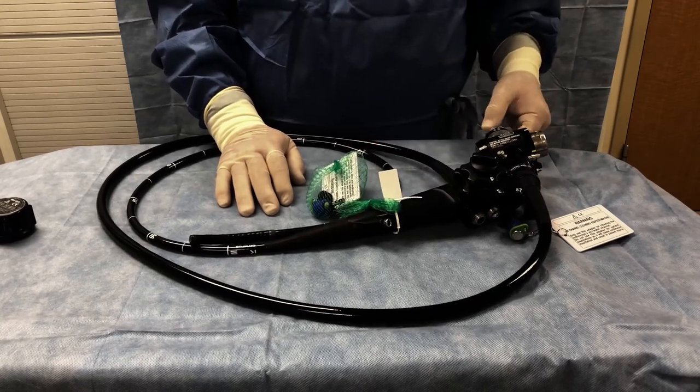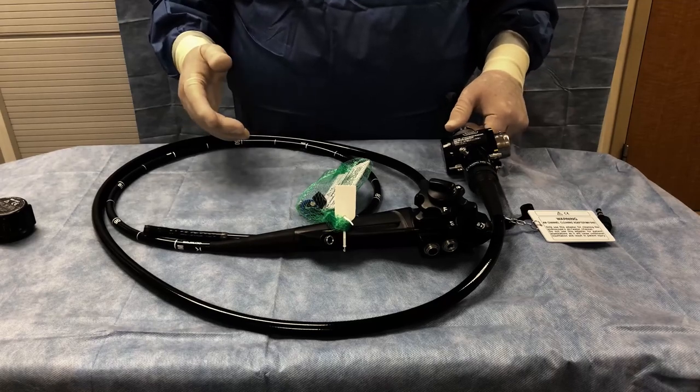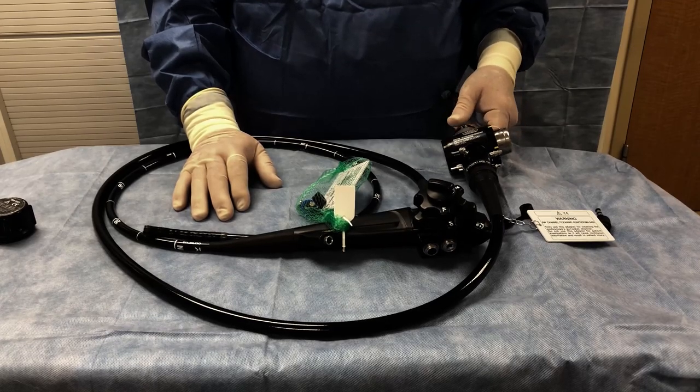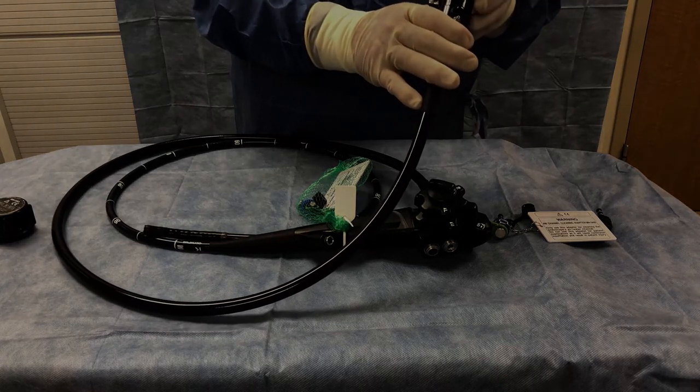That pretty much sums up everything about the gastroscope. This is a series 180 scope. We also have a series 190 scope — the difference is the 190 scope has a slightly different connector, and I will show you that on the next scope.